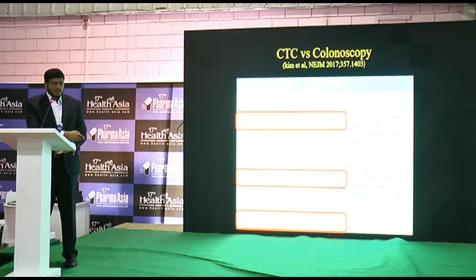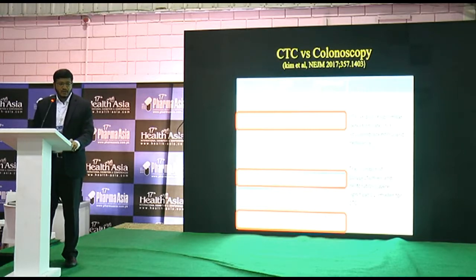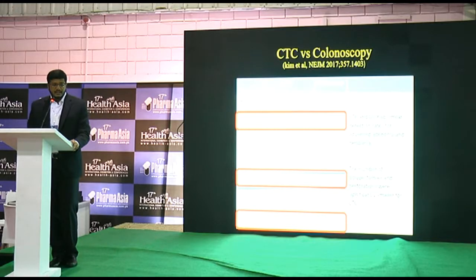Here is the comparison of CT colonography versus optical colonoscopy. Kim et al. showed that CT colonography and optical colonoscopy had a similar detection rate for advanced adenoma and neoplasia, while the number of polypectomies and perforations were significantly lower with CT colonography.